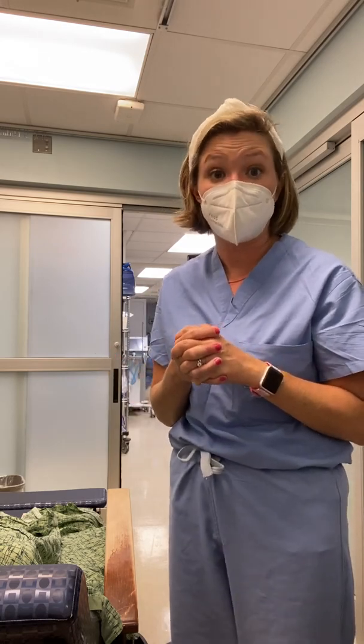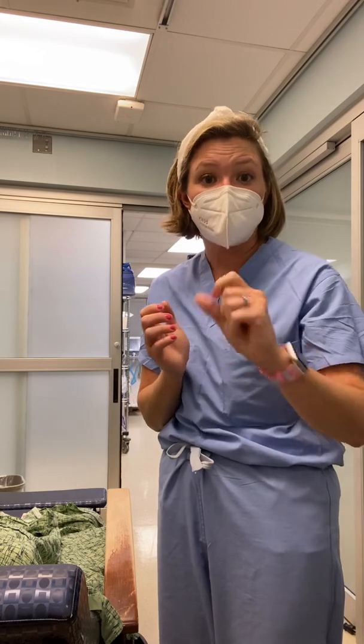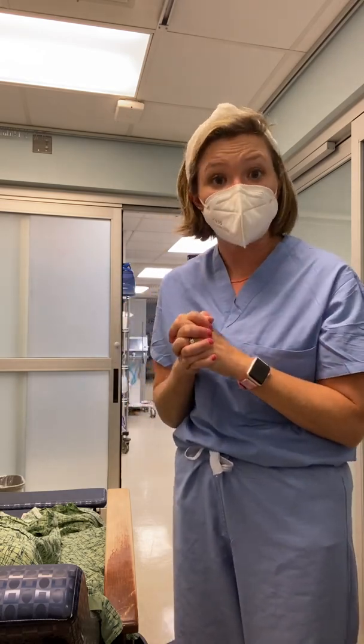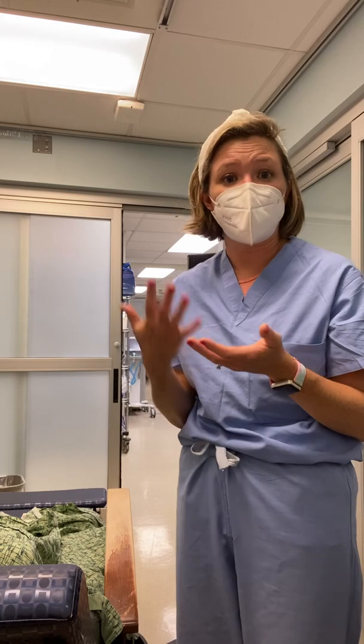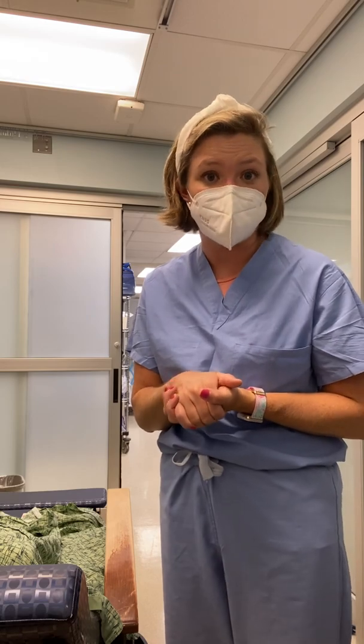On the next screen, if the patient has the order in Epic, you will be able to select the patient's name, click a button, select, and done, and that will load the patient in the machine for the provider to use during the procedure. If at any point you cannot find the patient and the order in the machine, you can troubleshoot it again through Epic by placing an order for US Guidance by Anesthesia.